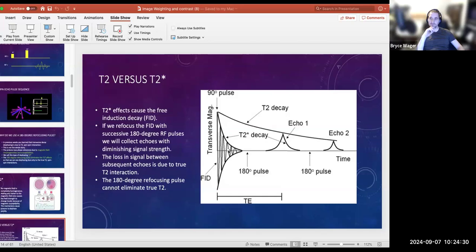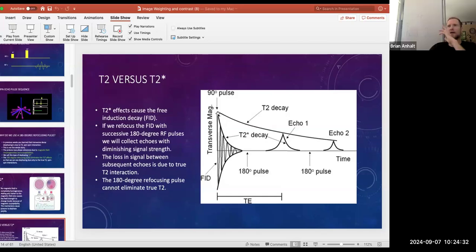It's not symmetrical. Yeah, there's no symmetry. There's also no contrast, potentially, right? We just did it right away. But yes, that's what I wanted you to say, was there's no symmetry there. We wait a little bit.